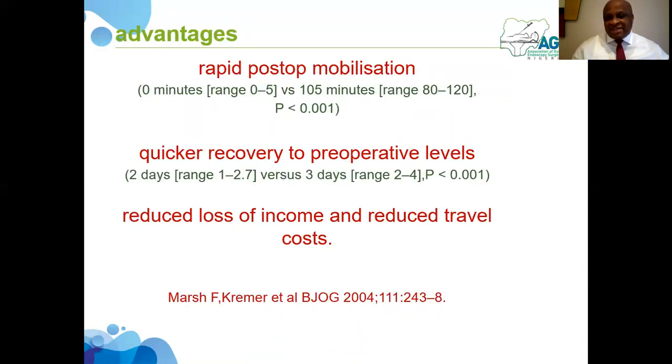The obvious advantages in performing hysteroscopy in outpatient include rapid post-operative mobilization, so they come in and go home the same time, even though we always advise that they come with an escort that will take them home. Recovery is obviously quicker, and they go back to work sooner rather than later. This all amounts to a reduction in the loss of income as patients go back to work much quicker than if they had general anesthetic.